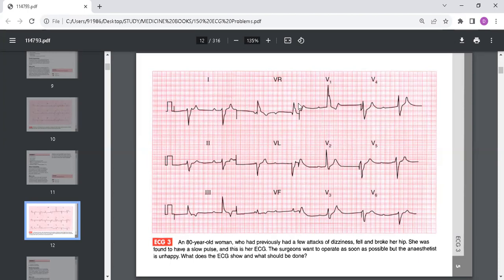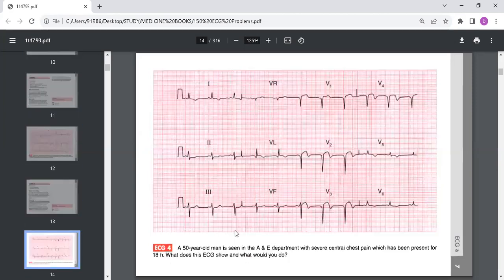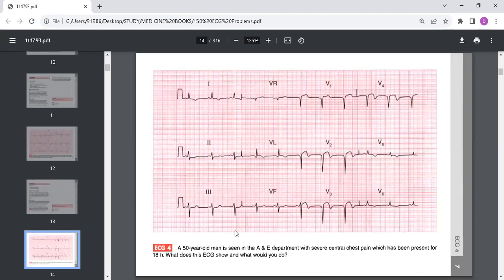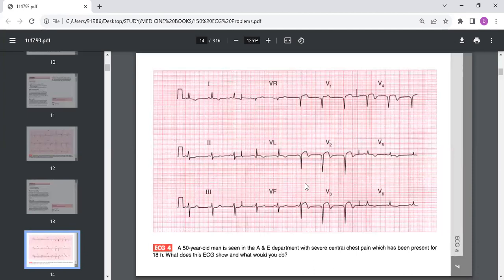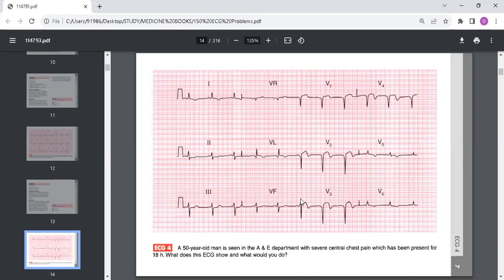We come to another ECG which is of a 50-year-old man seen in the accident and emergency department with severe central chest pain which has been present for 18 hours. What does this ECG show and what would you do? This ECG shows sinus rhythm with a rate of 64 beats per minute. The axis is normal.